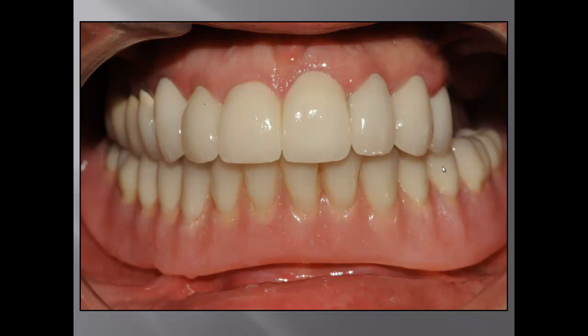When I cement my crowns, I start from my front teeth. I want to do a facially generated treatment plan, so I make sure my front teeth are in the right position. In order to avoid the problems in the future, with the patient in supine position, I put my forefinger horizontally on the front teeth and ask the patient to bite down. If I don't feel any fremitus on my front teeth, it's alright. But I'm going to check with the blue paper. If I see any streaks left on the front teeth, especially teeth 7 to 10, I will eliminate those blue streaks, I mean the sliding position. I'm going to leave them only on teeth 6 and 11 to give the patient canine guidance. In the supine position, I establish there is no fremitus.